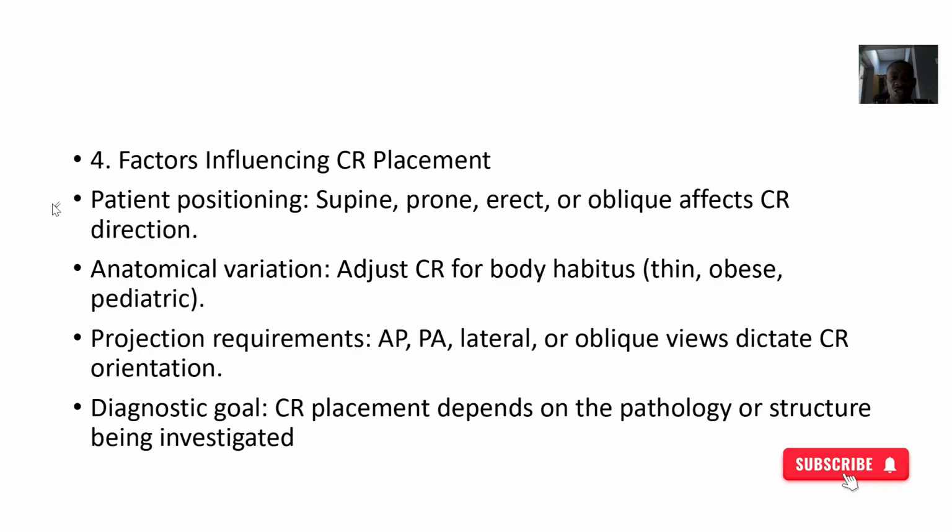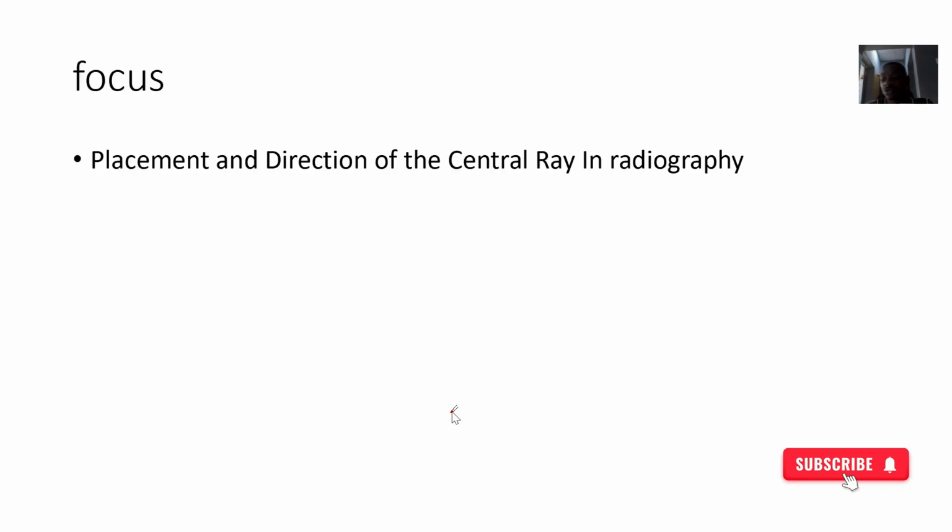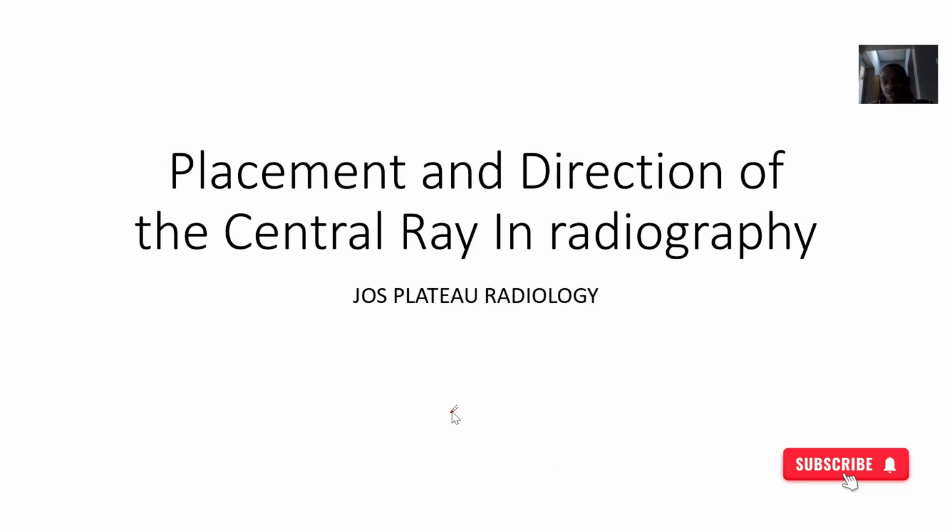You should make sure that your patient is positioned rightly. You should also take note that not all anatomical structures are the same in all patients, so you have to account for that variation and always arrange it individually. Do you understand? You must know the projection that you actually want, how you will position it, and the reasons. You must know what you want to diagnose. Of course, the person requesting the X-ray should give you at least an idea of the diagnosis, so you are working alongside the diagnosis that was written before.